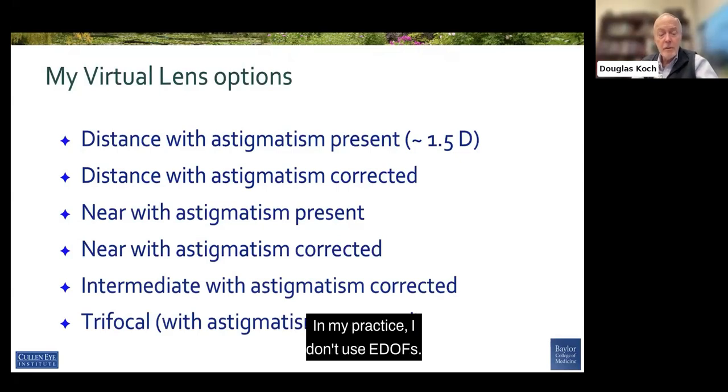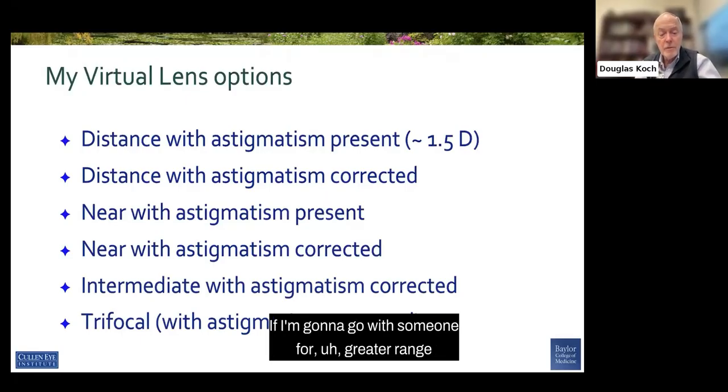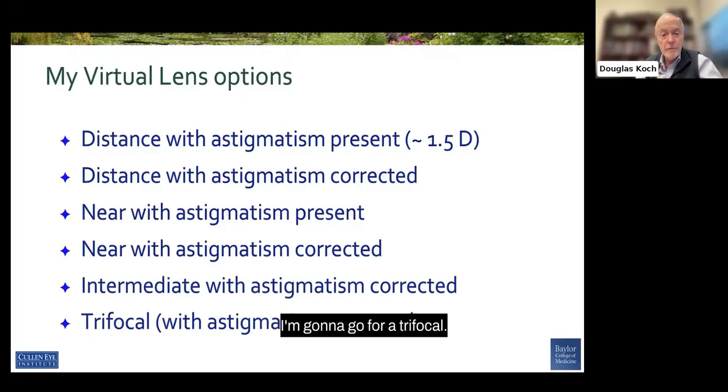In my practice, I don't use EDOFs. I'm so happy with the trifocals. If I'm going to go with someone for a greater range of vision or for a simultaneous vision IOL, I'm going to go for a trifocal.